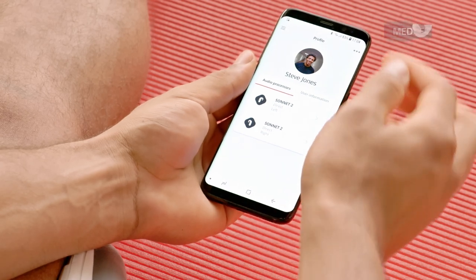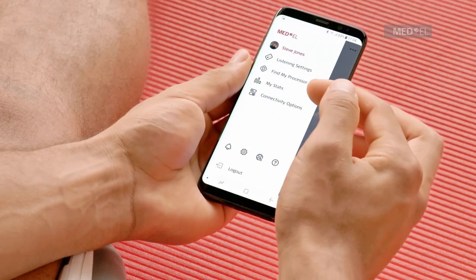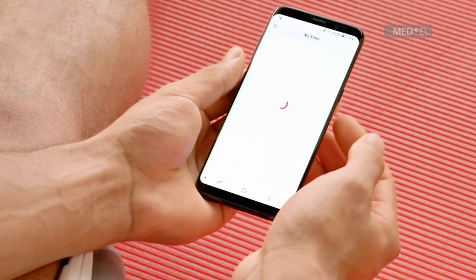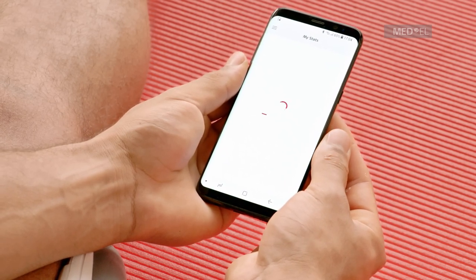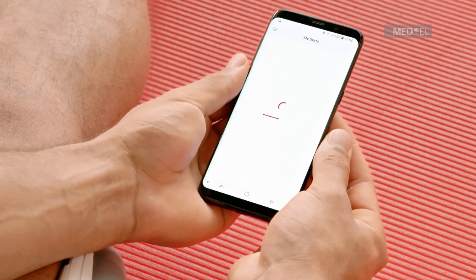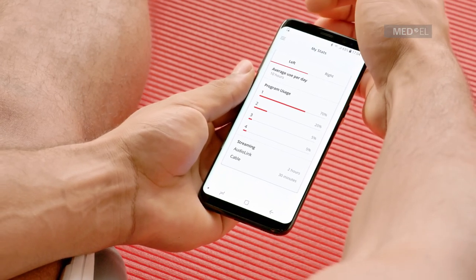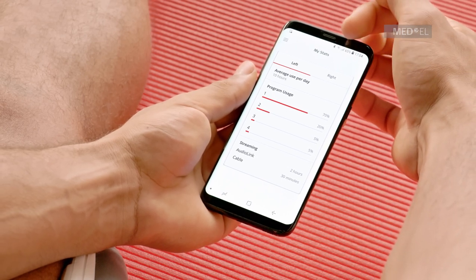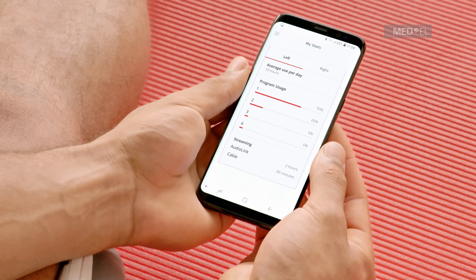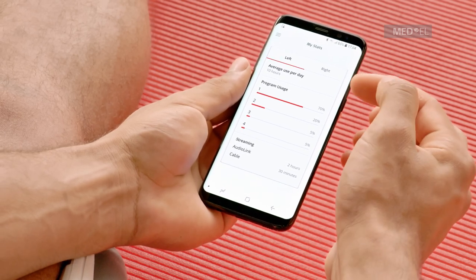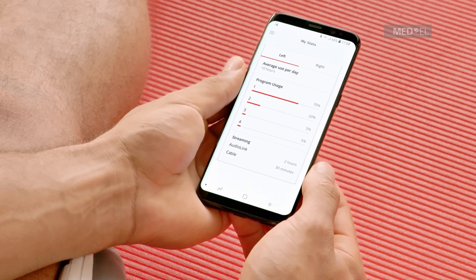With Audio Key, you can view your personal hearing statistics. Select 'My Stats' from the menu, then select which processor you wish to see statistics for. You can then see different information, such as how long you or the person you look after wears their audio processor each day, and which programs are most used. These hearing stats can also be used by your audiologist to help fit your audio processor to your hearing.